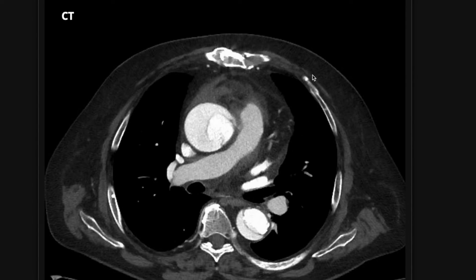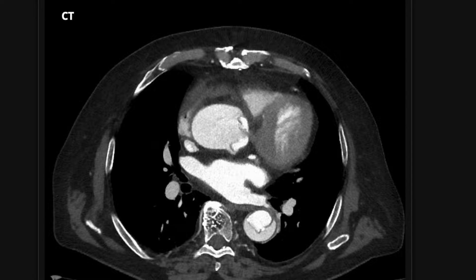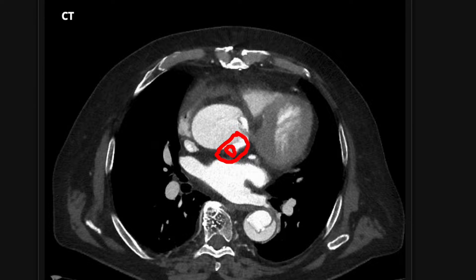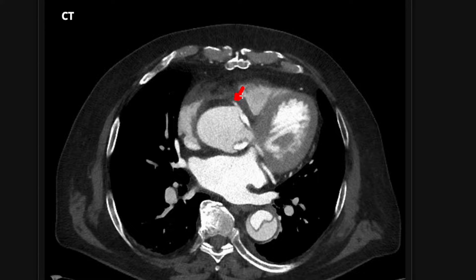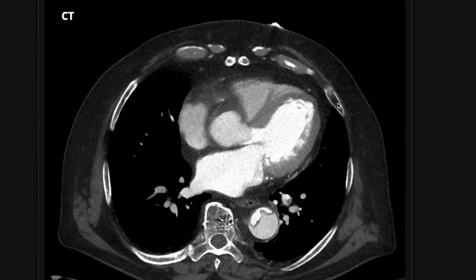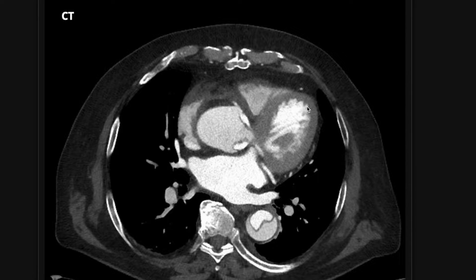Another thing to think about is whether the dissection flap involves the coronary arteries. Here's the origin of the left main coronary artery, and there's a little bit of false lumen — the darker part — involving that origin. That's important because if a coronary artery arises entirely from the false lumen, you can have a myocardial infarct. In this case, the right coronary artery is coming off the false lumen, which is important for the surgeon to know.